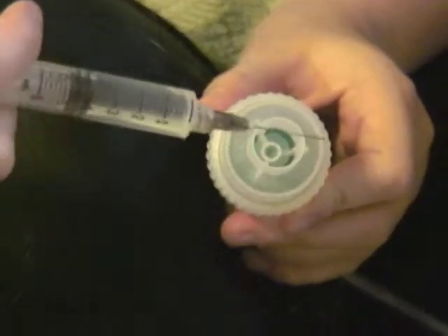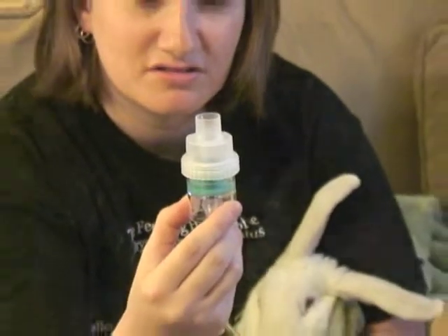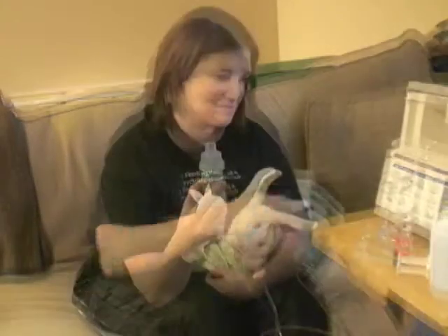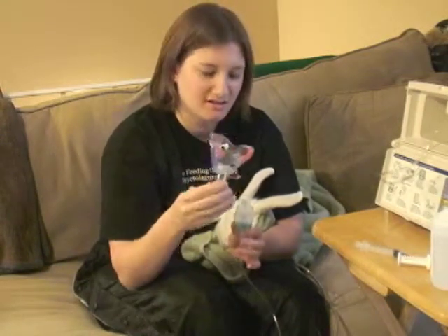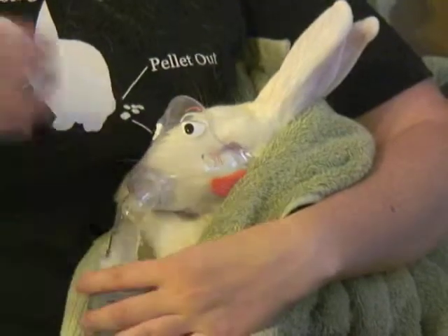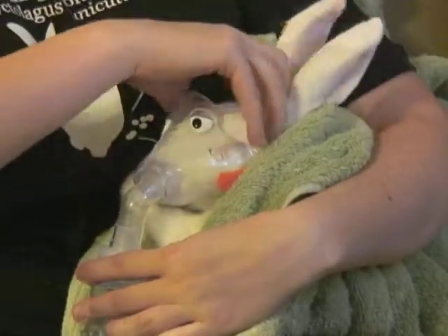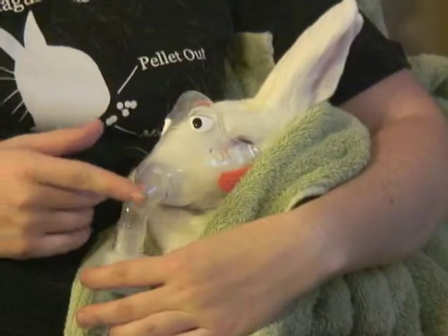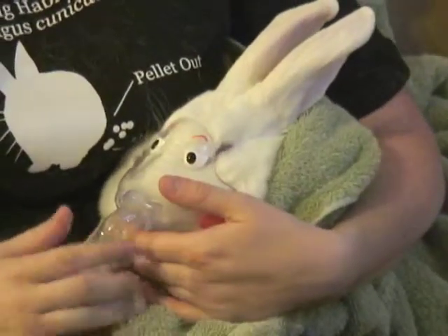I'm just going to put the needle off to the side so that it misses the middle and fills the cup. We have the Gentamicin saline solution and this is what she will be breathing. I put her mask — it's just a child-sized mask you can buy at any pharmacy — right on top. I kind of want the cup to be as vertical as possible. So for the next about 15 minutes I sit here and let her breathe this. The mask doesn't have it directly jammed into her nostrils; it just kind of rests along the contours of her face.